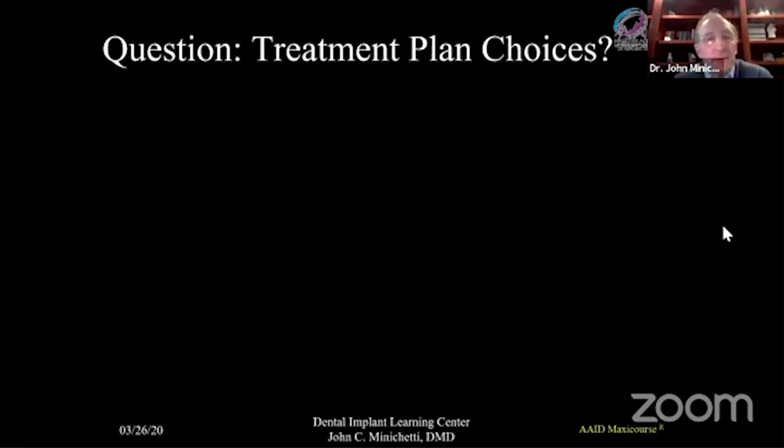Another suggestion, combined implant and natural teeth, maxillary reconstruction, restore the vertical dimension. Absolutely excellent choice by Dr. Antonella. Thank you, Dr. Antonella. Dr. Shah: extract retained primary teeth, socket preservation, implant placement. Absolutely. These are all what's going through our heads as we're planning this.